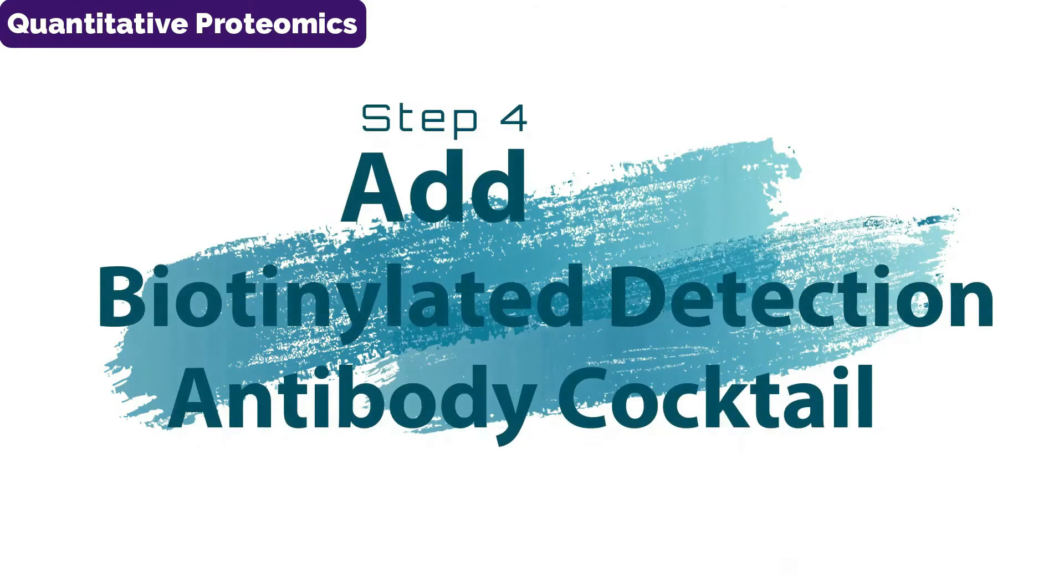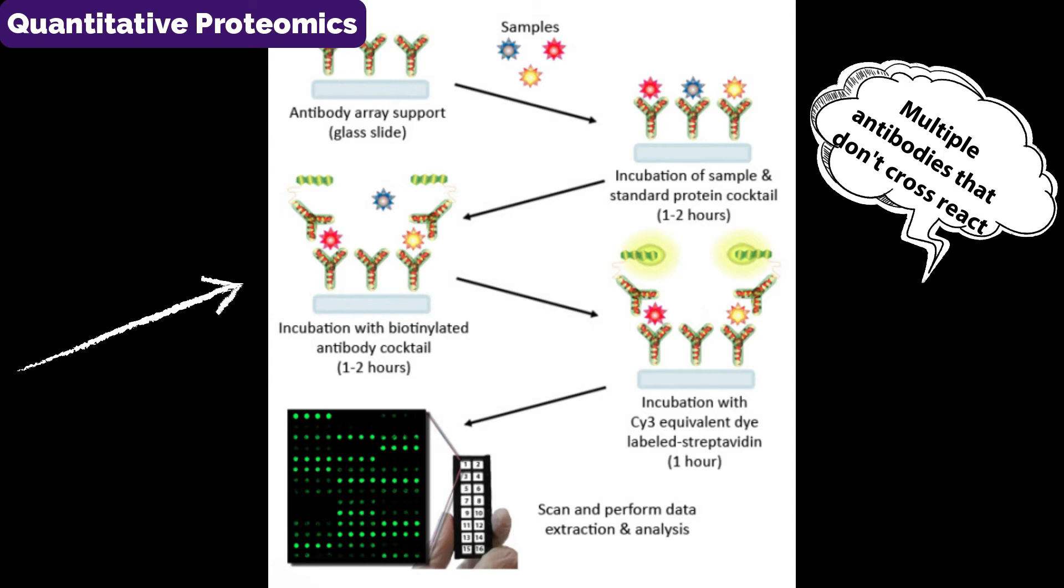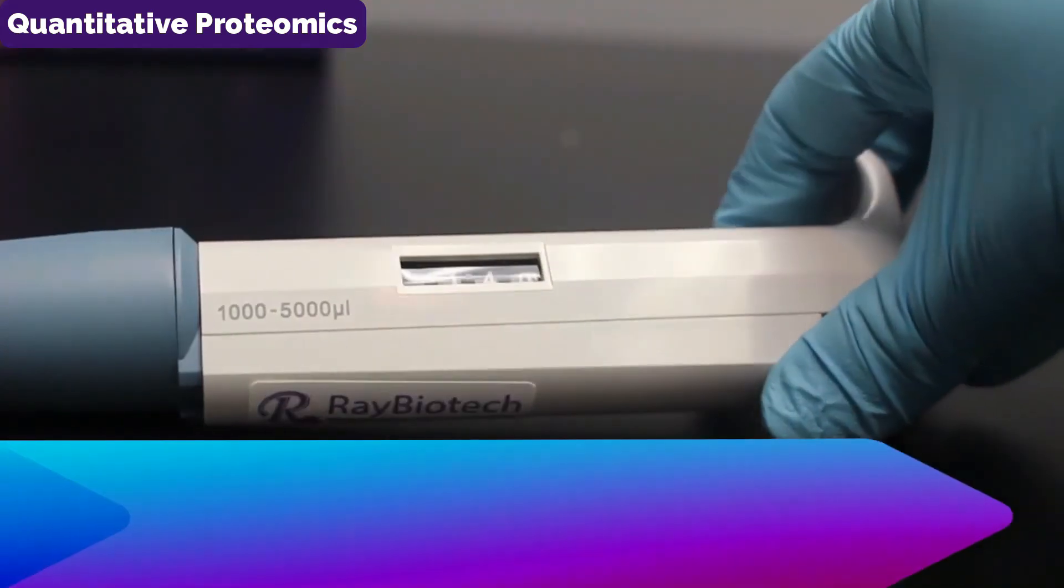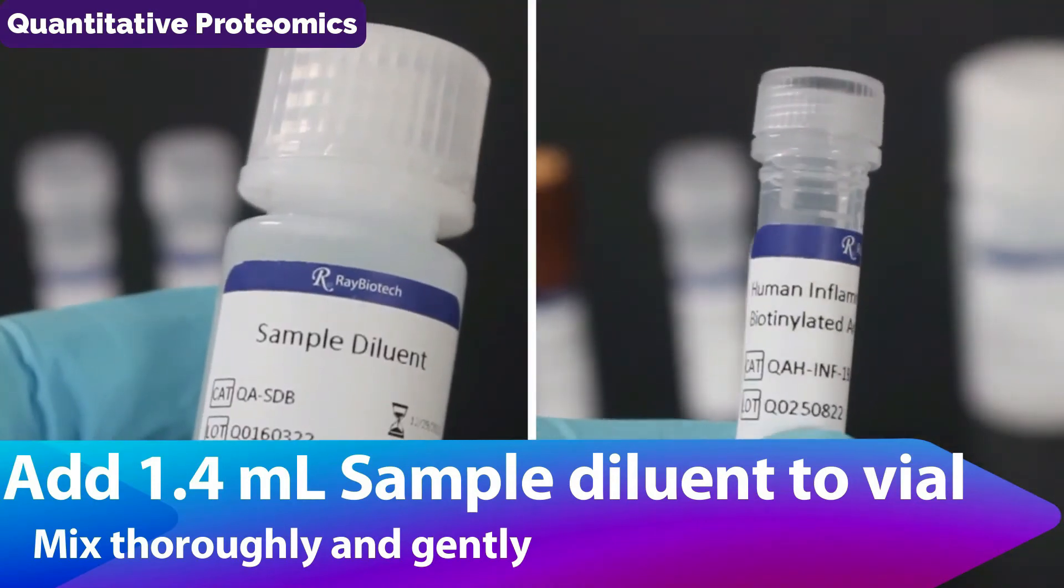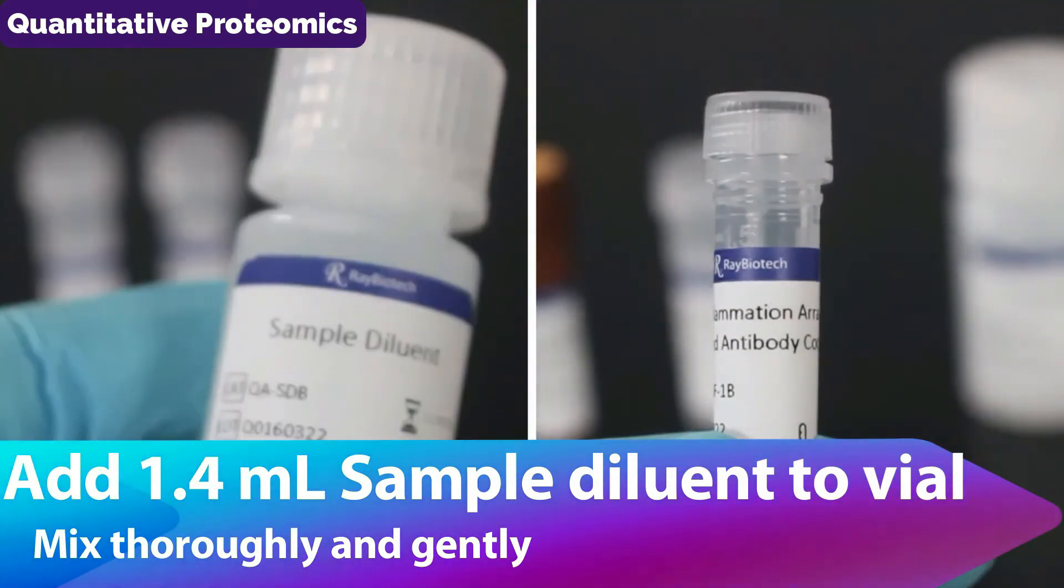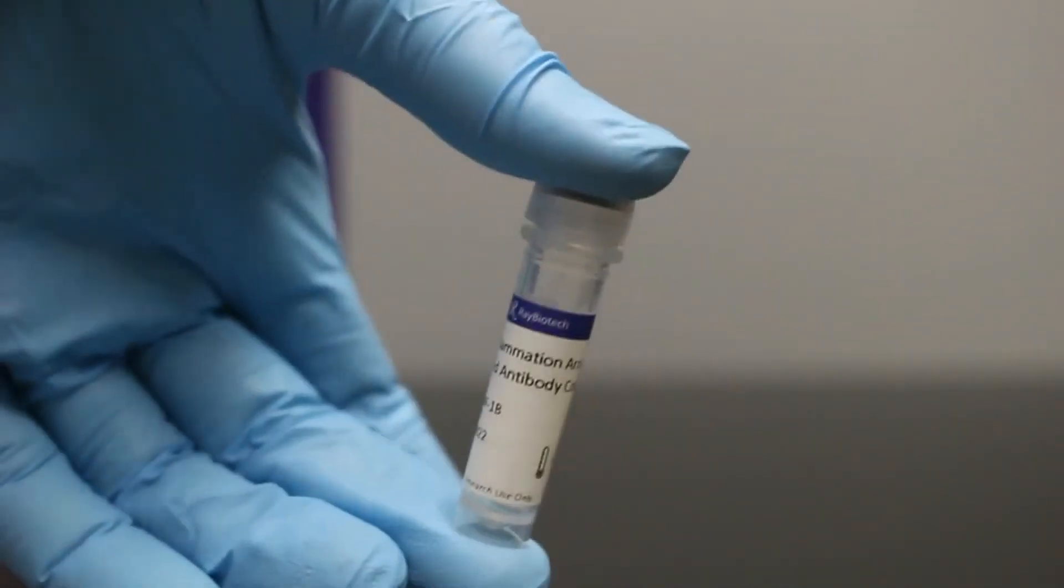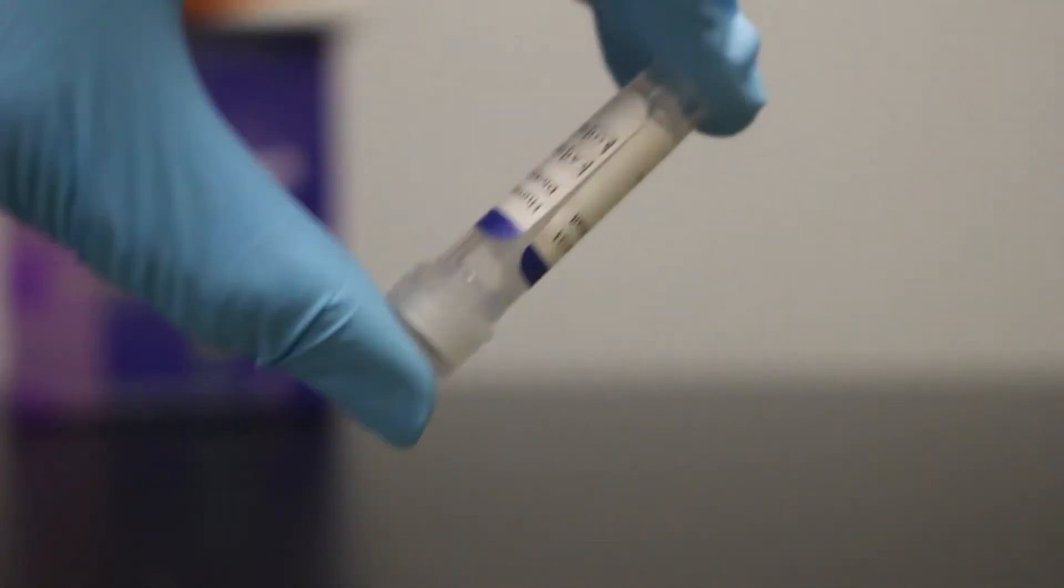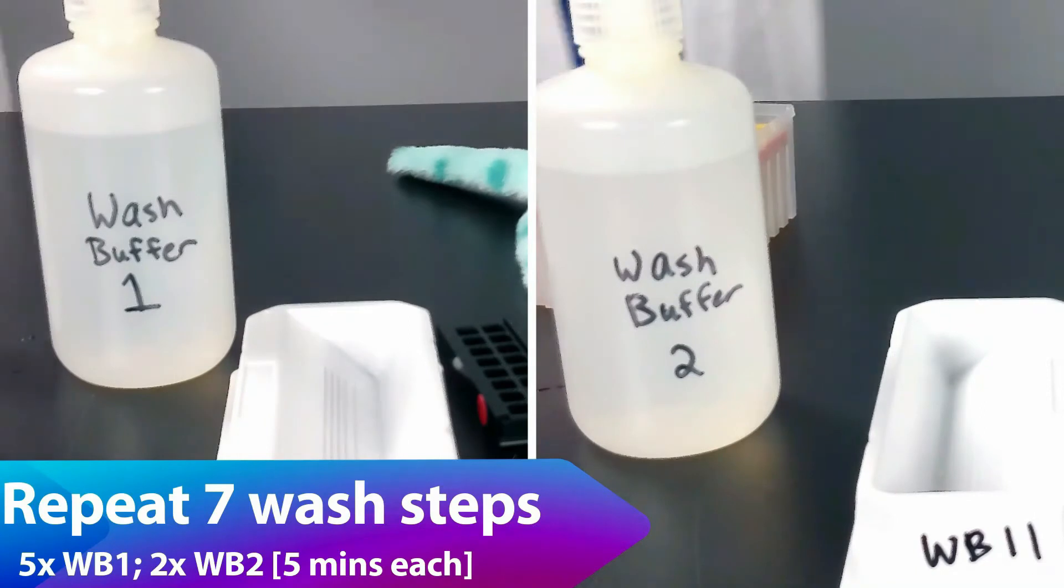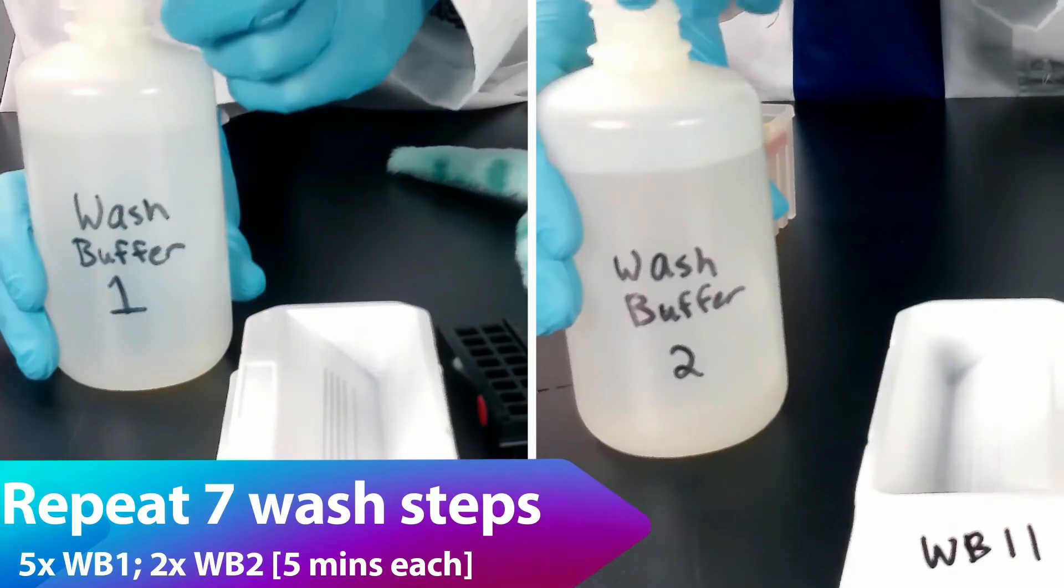Now that the antigens have been captured, we need to detect them using a biotinylated detection antibody. Remember, there are multiple detection antibodies in the cocktail, each formulated to minimize cross-reactivity. First, reconstitute the vial by adding 1.4 milliliters of sample diluent and mix thoroughly and gently by repeated inversions or repeated pipetting. Repeat the same wash buffer steps with wash buffer 1 and wash buffer 2 as you did between the previous incubation.